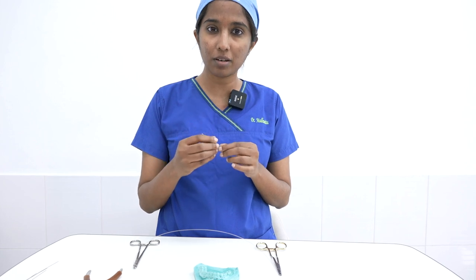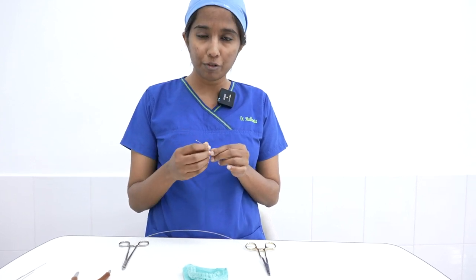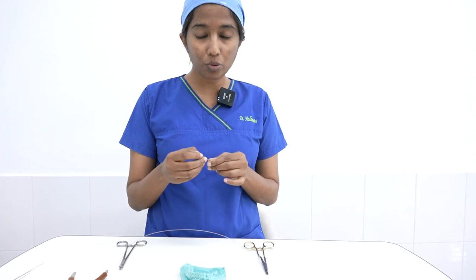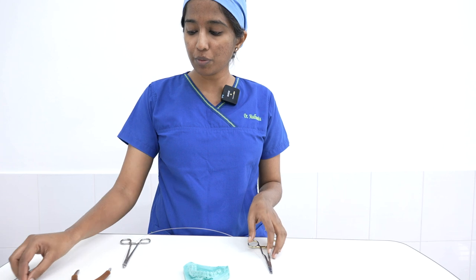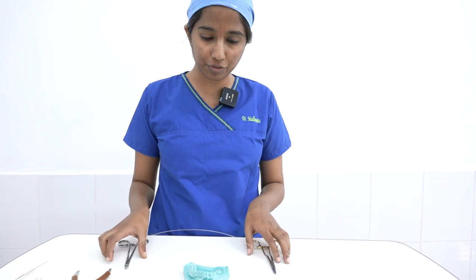It is also used for reducing fractures to secure the fracture segments, and used in orthognathic surgery for the purpose of splints. Before we go on to how to make this eyelet, I will be demonstrating how to stretch a wire first.